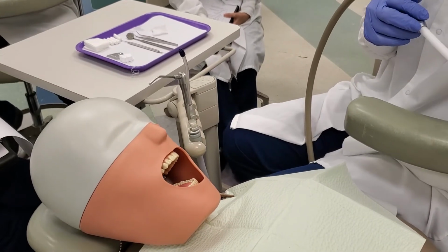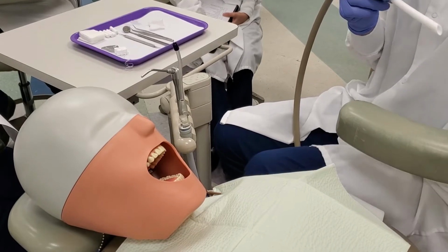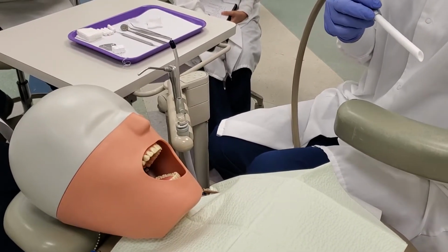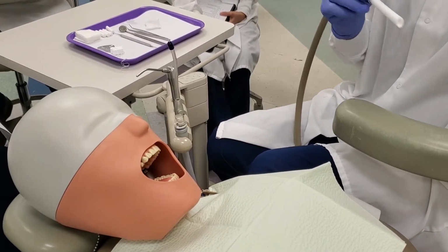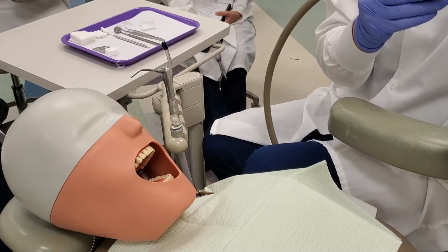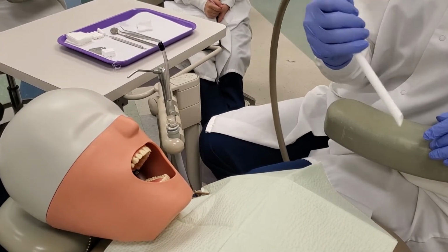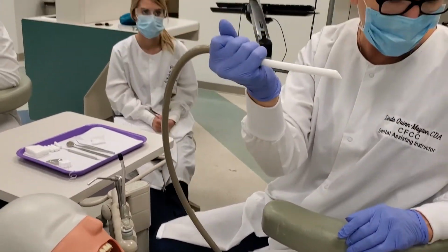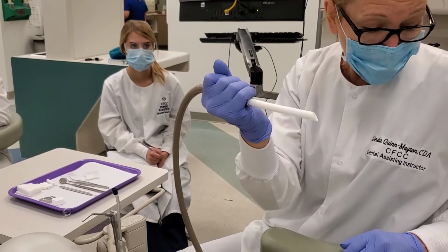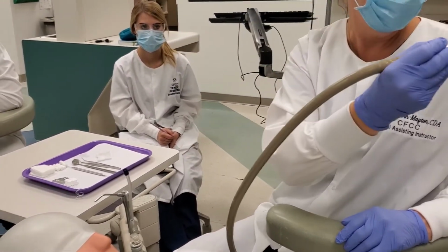So using the HVE for suctioning, and the dentist is working on an individual tooth. I'll give you a tooth number. For your assessment, I'll be, 19, 14, 30, number 3. I'll give you a tooth, so I want to see where you're positioning this, how you're positioning it. All right? So hold the HVE control in the right hand, always using the palm-thumb grasp when retracting tissue. And then you're going to hold the HVE control using the pen grasp, okay?